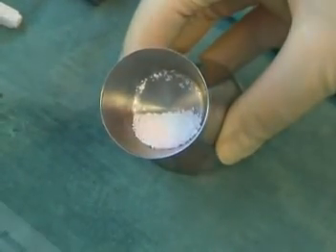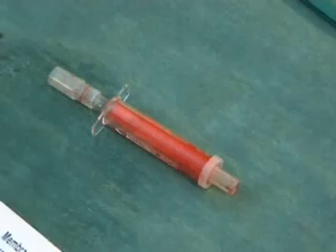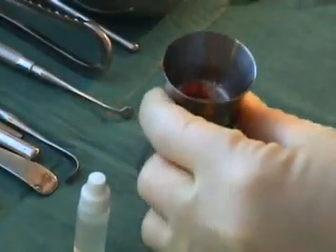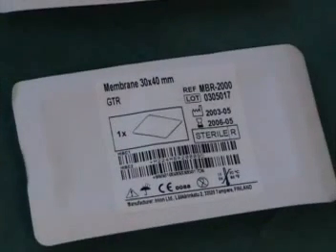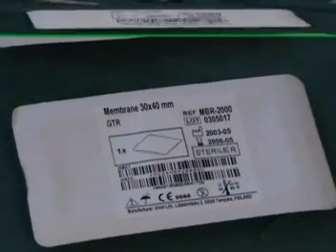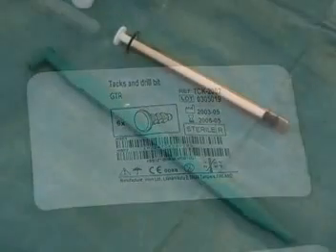A particulate graft in combination with autogenous bone derived from a bone trap at time of surgery will be used in combination to carry out the bone augmentation. The Inion biodegradable membrane system is used to prevent the downgrowth of soft tissue, connective and epithelial cells into the underlying bone during the healing period.